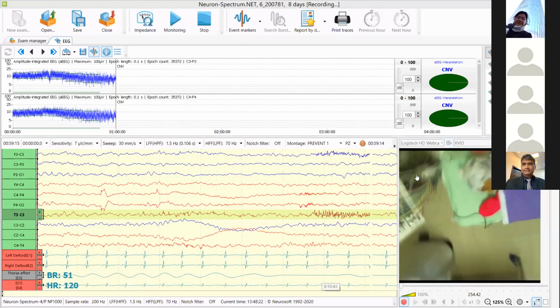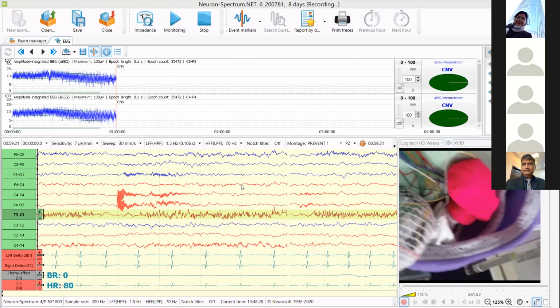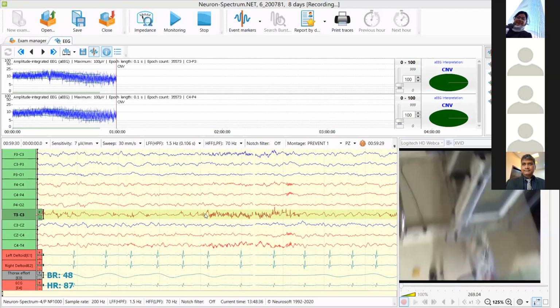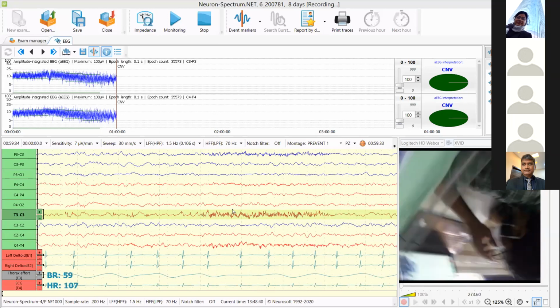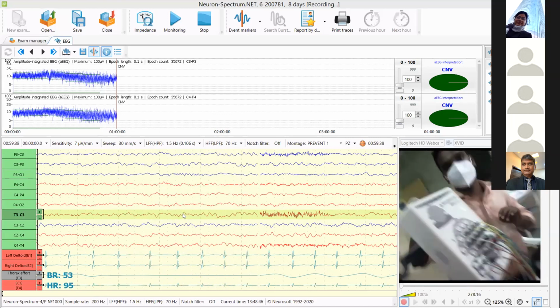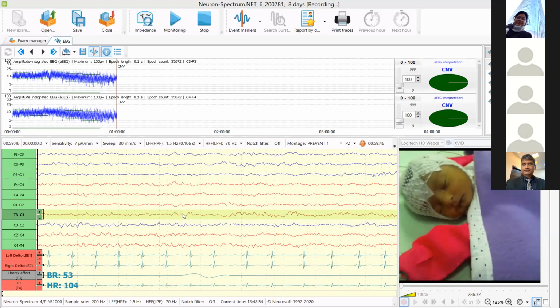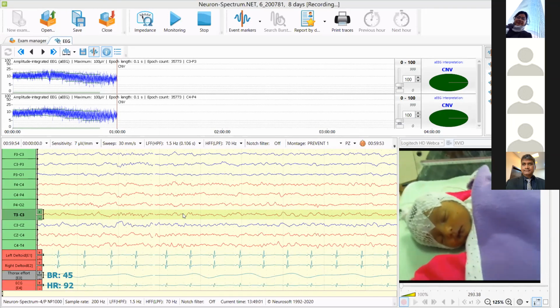Yeah, so this is a baby whom they're doing an EEG on in Calicut, in Kerala. So thank you. I'll just go through the software first. This is the Neurospectrum software which we use in Calicut. Today we have a baby's follow-up EEG. This was a term baby who had a clinical seizure on the third day, following which the baby was started on phenobarbital. Now this is day 7 of the baby, and after stopping the phenobarbital for the past 3 days, we are doing a follow-up EEG.